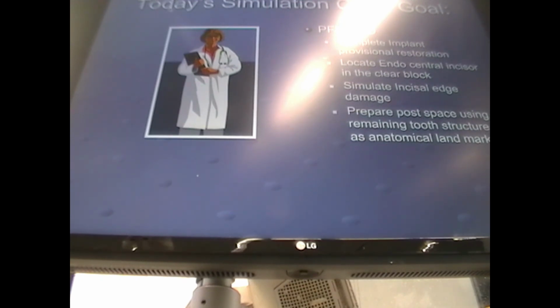Remember what I said? You want to have a decent looking soft tissue cast mounted. It would behoove you to have an exposed margin on the implant platform so that you can see your margin and finish your margin with your provisional restoration. Dr. Graves likes these provisionals that you'll have to make after prepping the provisional abutment. She likes the margins to have a nice little 1 millimeter round ring on the cervical third of your provisional.